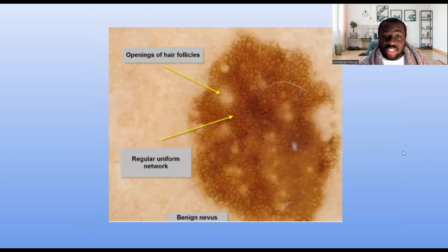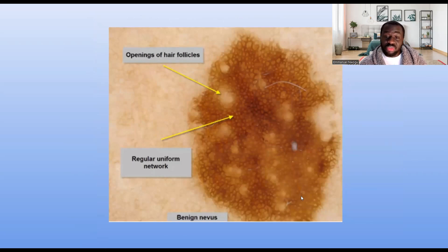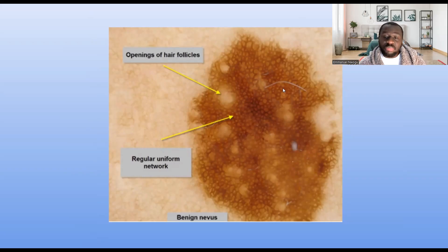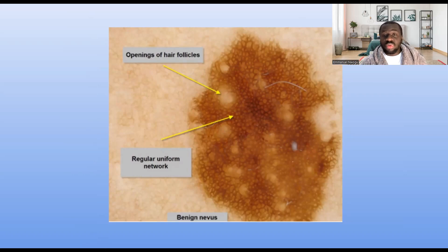This takes us back to the first photo, just to summarize. Things you commonly look out for: symmetry of the lesion — is it symmetrical or asymmetrical? A benign melanocytic nevus is symmetrical; dividing it into two halves gives you equal halves. It has a reticular network, like a net or mesh, and it has a uniform, homogeneous reticular network. The density of pigmentation is homogeneous or uniform. These are features that usually tell you this is very likely a benign melanocytic nevus. If you watch this video and then watch the video on the dermoscopic appearance of a melanoma and place them side by side, you'll appreciate the difference and gain a lot of diagnostic clues as to whether you need to be worried about a lesion or not.